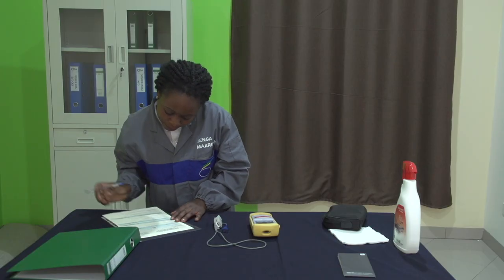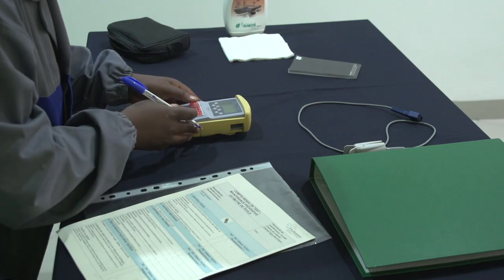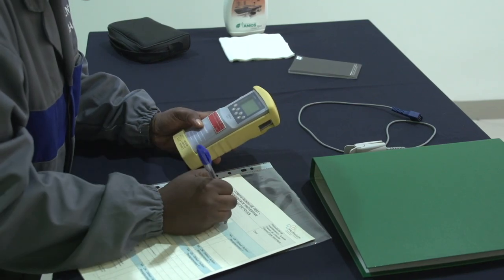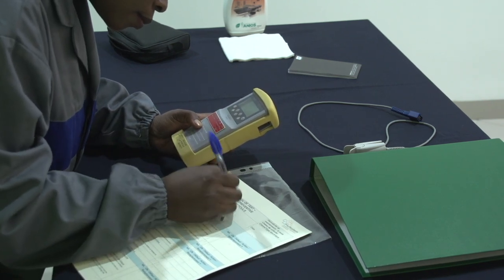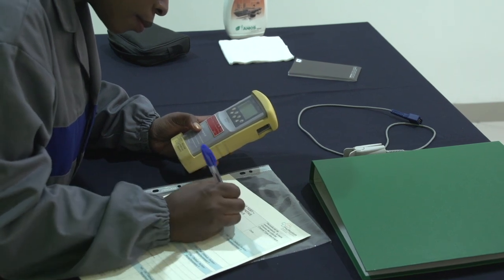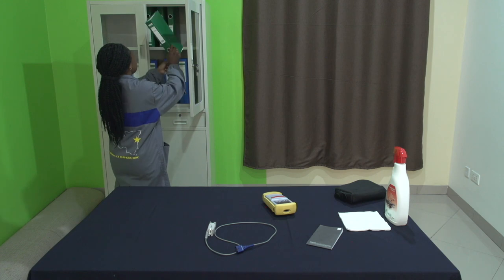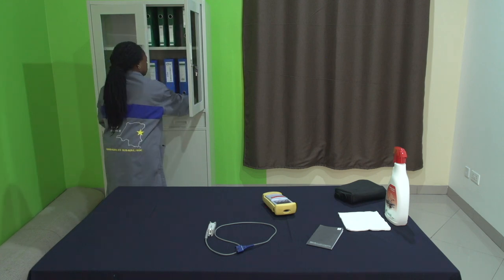Une fois que nous avons vérifié notre appareil en suivant toutes ces étapes, n'oublions pas de compléter et d'archiver ce compte rendu et d'enregistrer les résultats de cette maintenance dans nos outils de suivi. L'appareil ne peut être rendu au service utilisateur que si et seulement si toutes les étapes sont validées. Sinon, il y aura des petites réparations ou des achats d'accessoires à prévoir en remplacement. À vous de jouer !